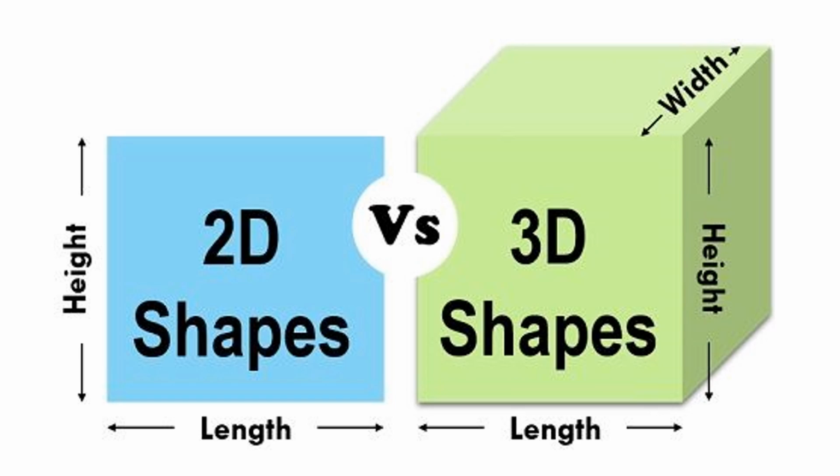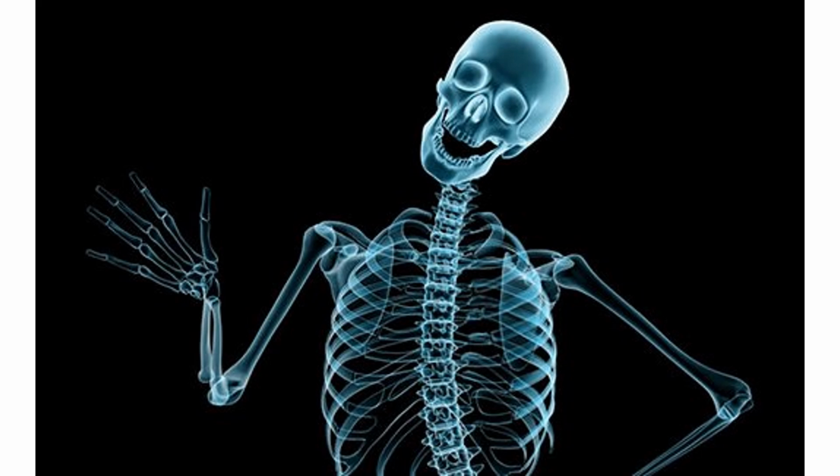So why 3D? Why three-dimensional? Because if it's 2D, we are going to talk about the height and length. But if it's 3D, we add the width, and really this is quite important. This is a 2D X-ray.